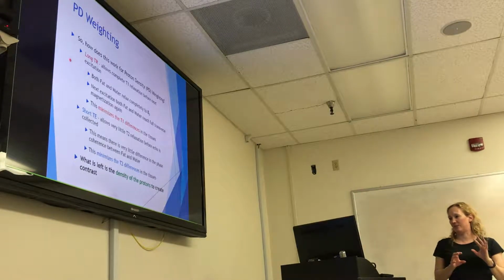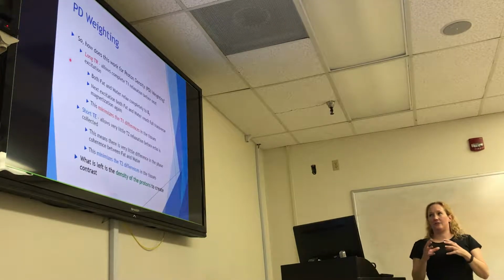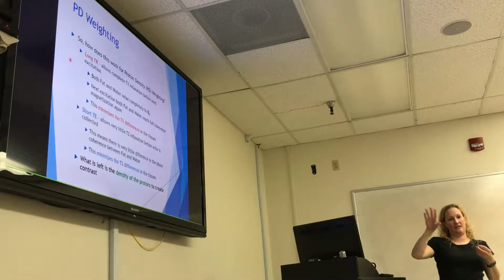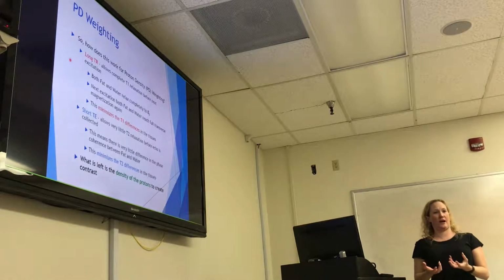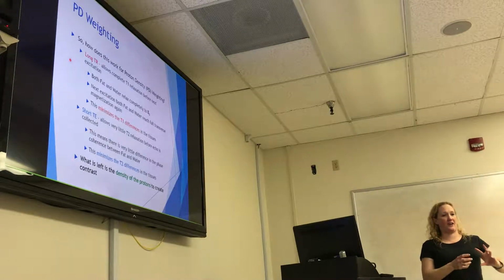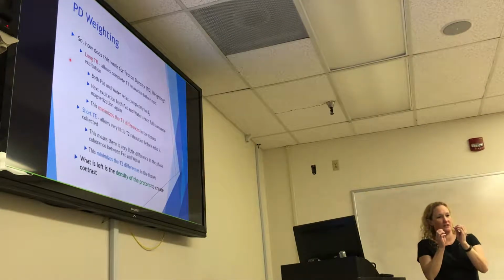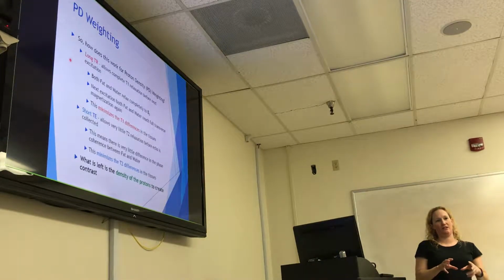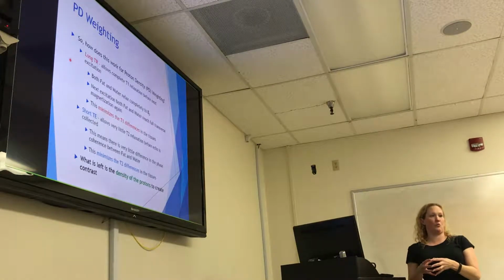First, I think there was a question maybe from last week that I wanted to save, that someone asked about the density of the tissue versus what proton density means. So this is just talking about the density of the actual protons, all right? That doesn't necessarily have anything to do with how dense the actual tissue is on a larger scale. We're talking on that atomic level scale, okay? So it's just about the density of the protons, not necessarily water versus blood versus, you know, liver, muscle, or bone. It's just the density of the actual protons, okay?